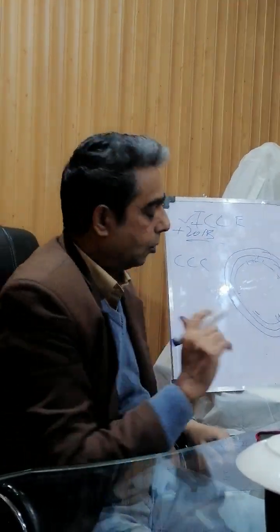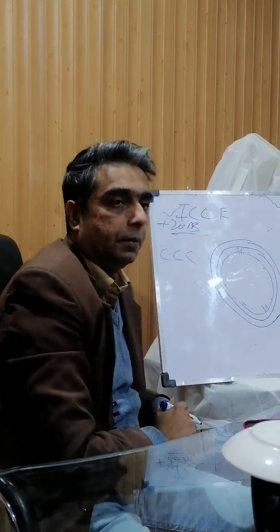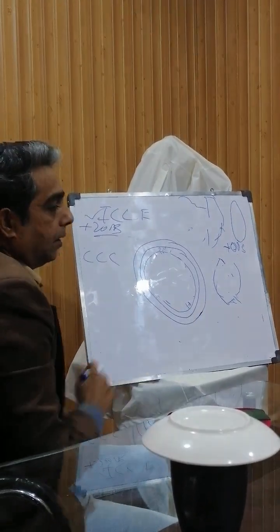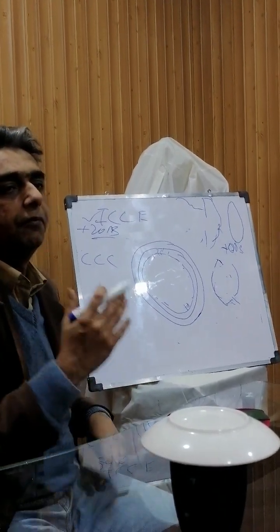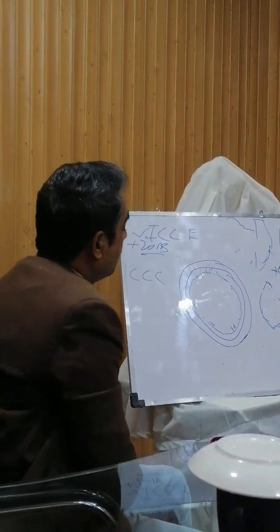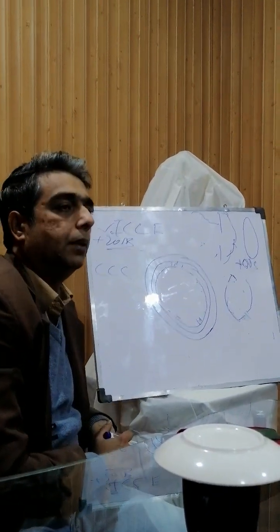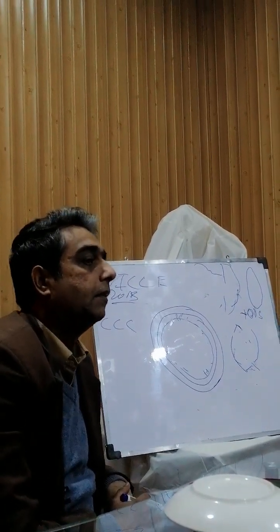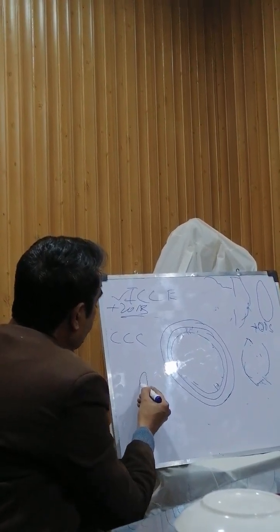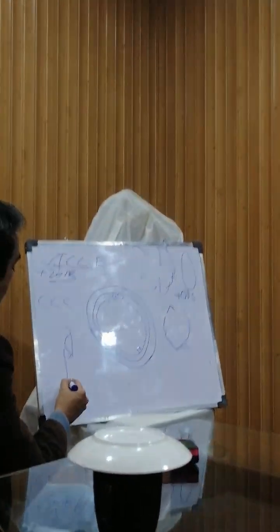Understood? Okay. Now we have an incision of 2.8 millimeter, just 2.8 millimeter. Now the lens diameter previously used to be 6.5 millimeter. Then it became 6 millimeter. Now for phacoemulsification from this incision it is not possible. Now we have a 5.5 millimeter lens, but even that is larger. So the lens comes in a foldable form. This is a 5.5 millimeter lens which comes in an injector.